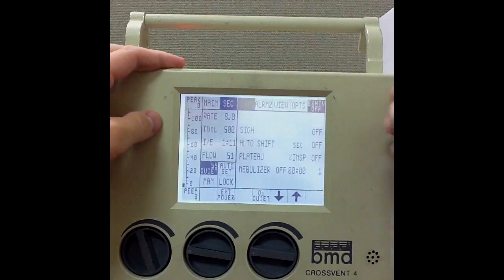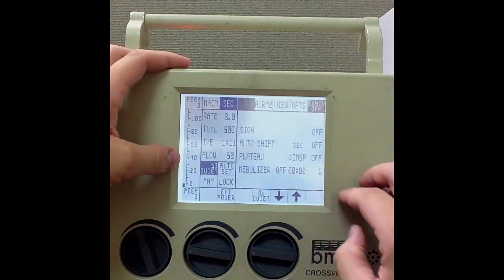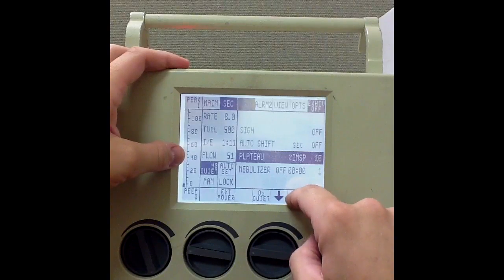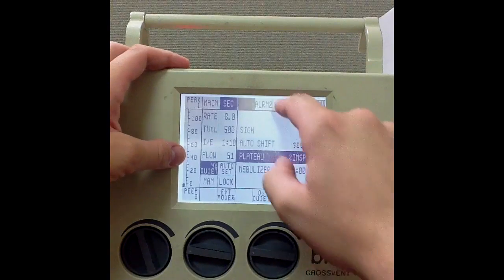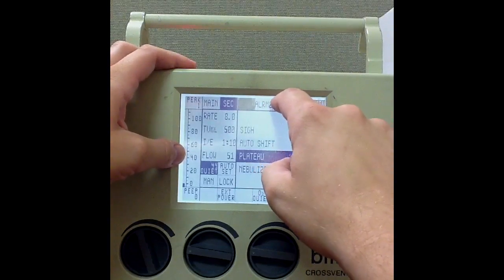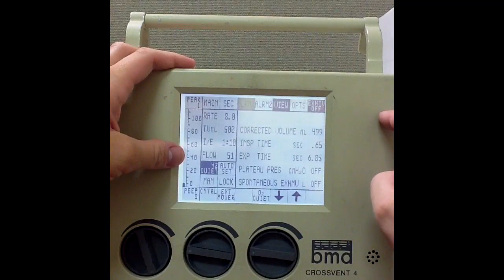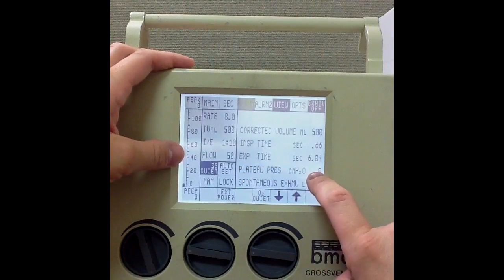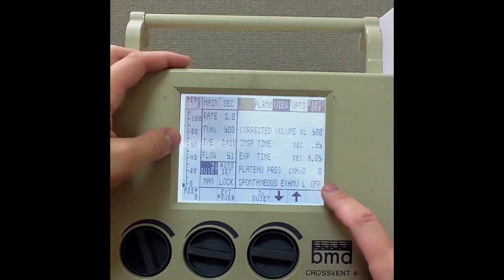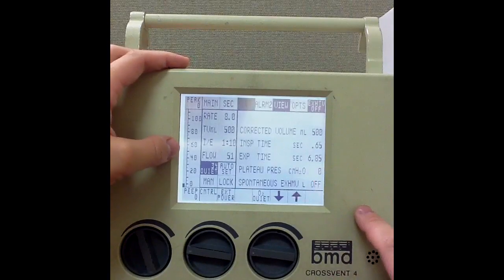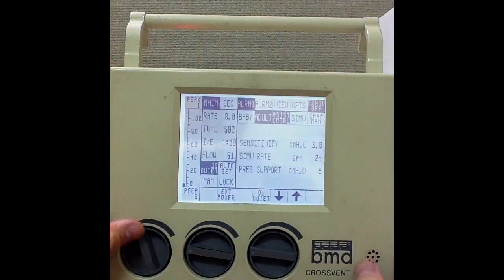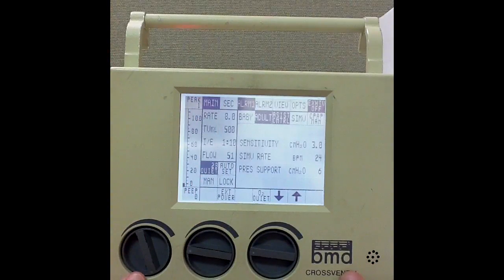I'm now at the secondary screen. I want to go ahead and initiate an inspiratory hold so I can monitor my plateau pressures. I'll put that at 10%, then I will go to my view. My plateau pressure now goes from off to 0 — obviously it's 0 because I don't have any pressure — but that's where I monitor my plateau pressure. At this point I am now set up for basic adult mechanical ventilation.